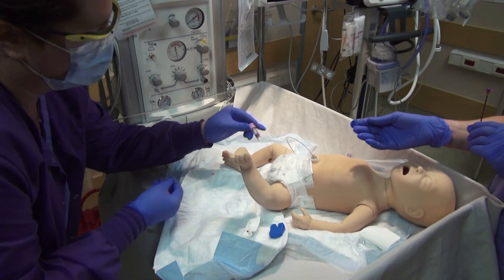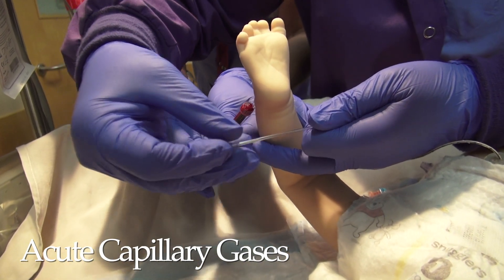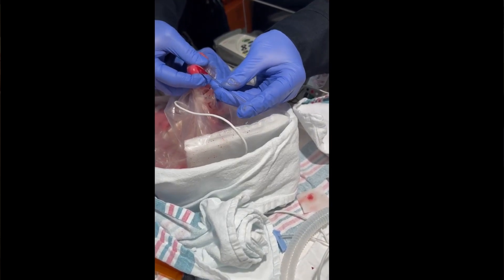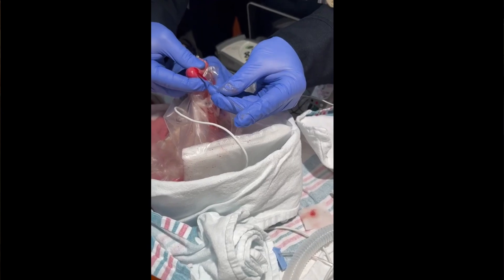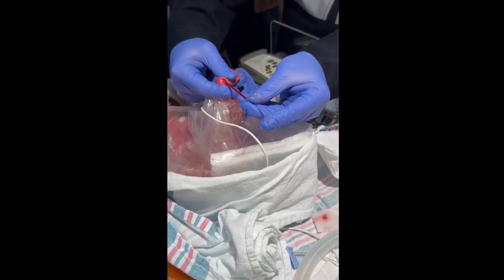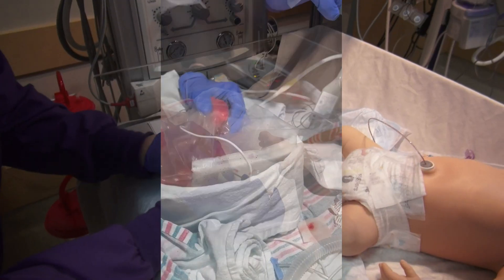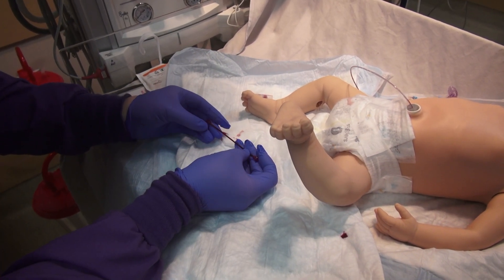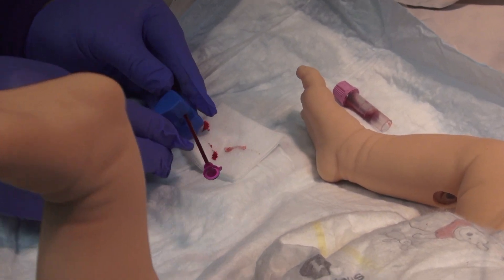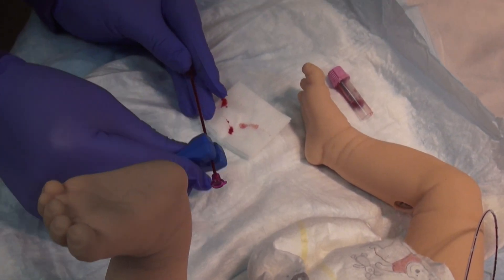Do not go over the second fill line. Acute capillary gases: Use the capillary tube located in the pre-made kit. Put the magnetic flea into the heparinized capillary tube. Hold one end of the capillary tube horizontally into the forming blood drops, filling the tube and keeping the air out. Once it is full, place both caps on the ends. Use the magnet and run it back and forth ten times — this enhances the mixing. Label the sample by applying the label on the very tip of one of the purple ends, and pass or bring the samples to the lab immediately.